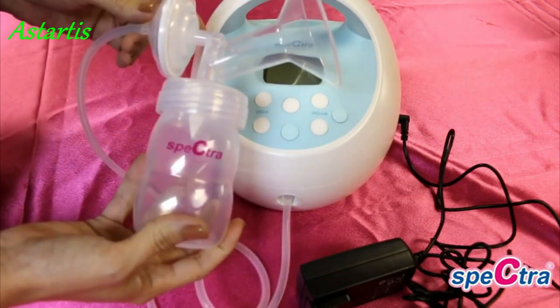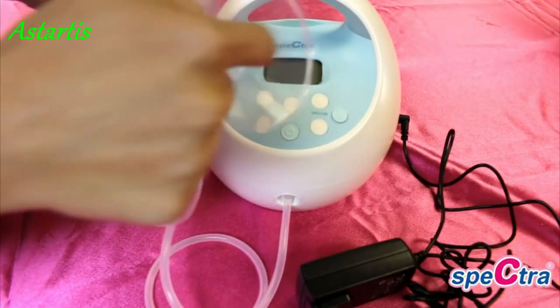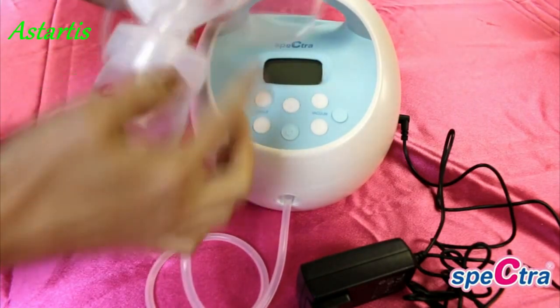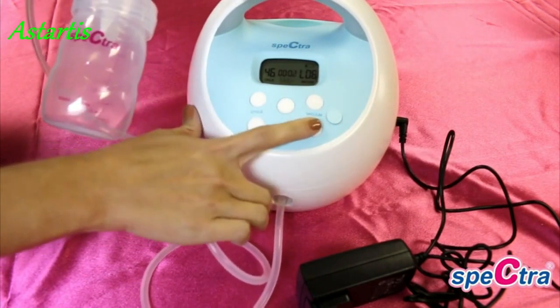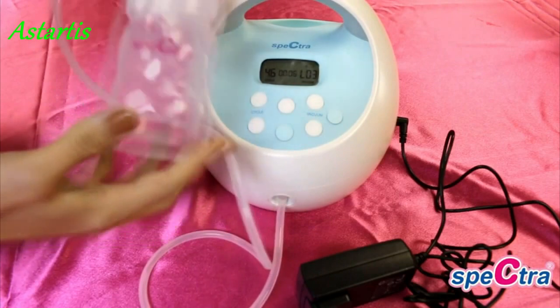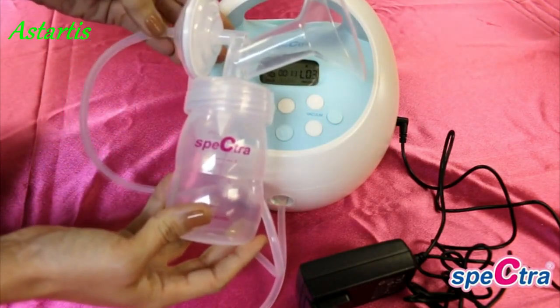If you are experiencing pain while pumping, check your breast shield size. Make sure that your nipples are not rubbing on the edge of the shield. Also, check to make sure the suction level is not too high. Try decreasing the suction strength to see if you have no pain. You should not experience pain while pumping if pumping properly.